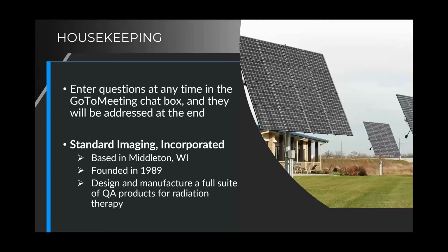We've got a lot of history behind us, and as such, we design and manufacture a full suite of QA products. You probably know us for our well chambers, electrometers, and ion chambers. We also have a full suite of software, including the PIPSpro software, our IMSURE secondary check software, our Adaptivo software for patient dosimetry, utilizing the EPID, as well as an adaptive module contained in it, and also our LinACView software, which is a log file monitoring software, as well as others, and then a whole host of phantoms, including the Lucy Phantom, which is kind of the gold standard for stereotactic QA. But anyway, let's move forward, and we can learn a little bit more about PIPSpro.